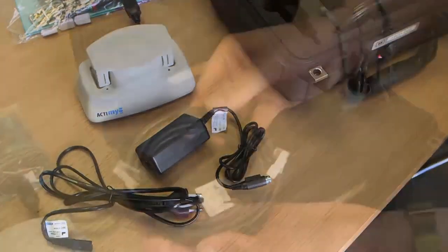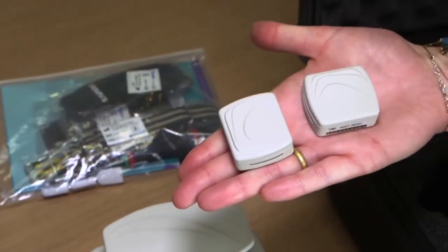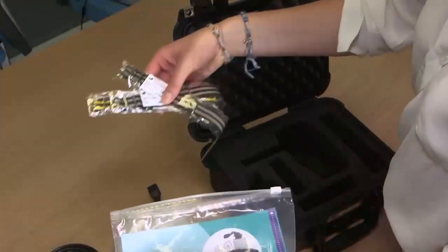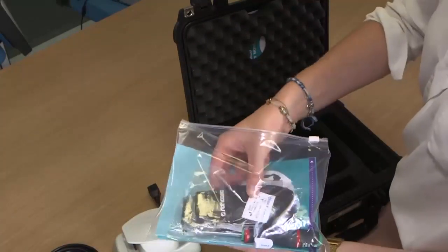Also included are the ethernet cable to permit interface with a router, the two sensors to permit daily activity recording, one participant manual and one task reminder, and bands for attachment of the sensors depending on the chosen configuration and ambulatory status of the participant.